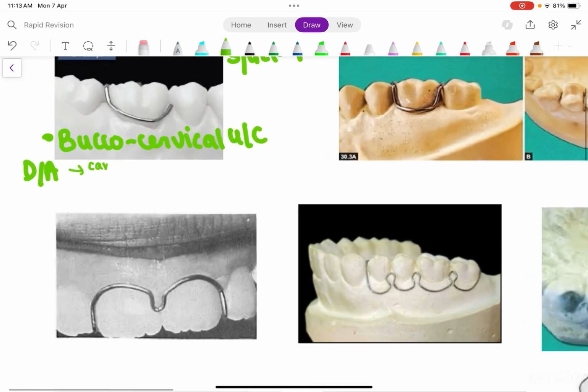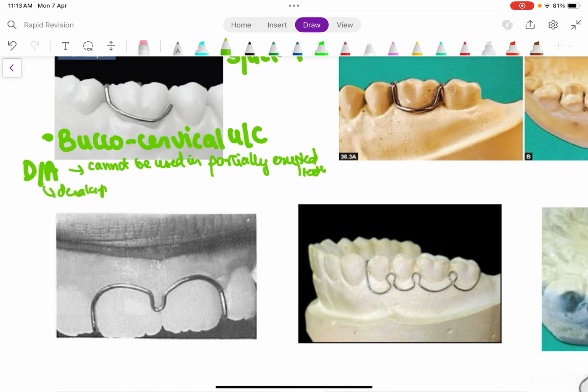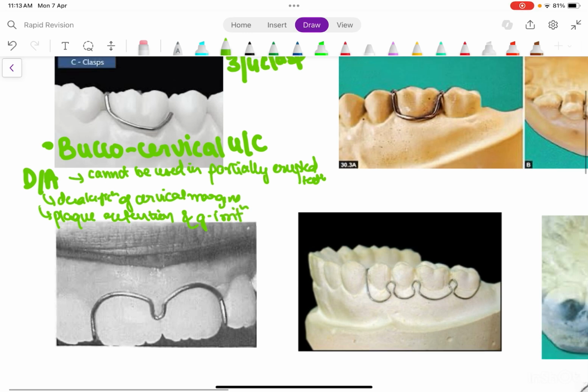All right, and the basic disadvantage is that it cannot be used in partially erupted teeth. Also, it leads to the decalcification of cervical margins and leads to plaque retention and gingival irritation.